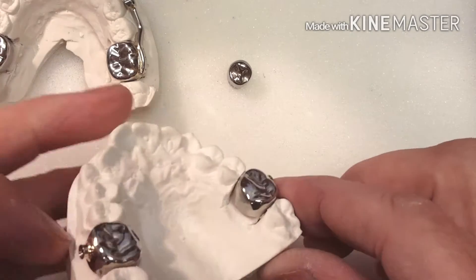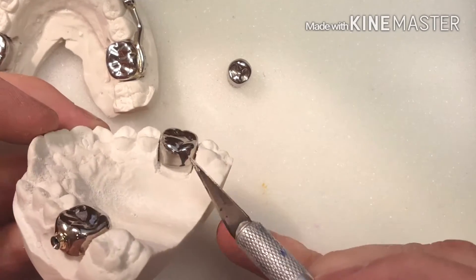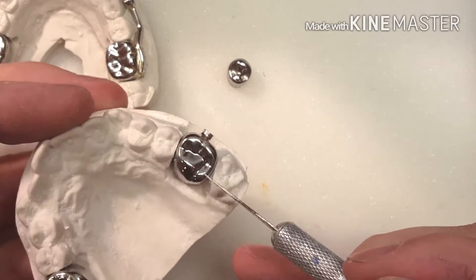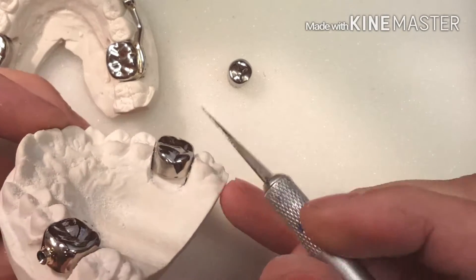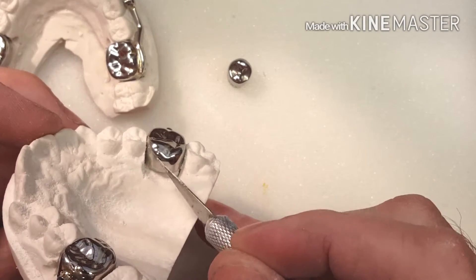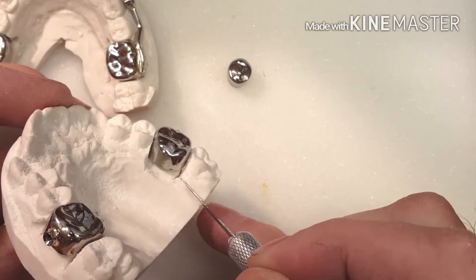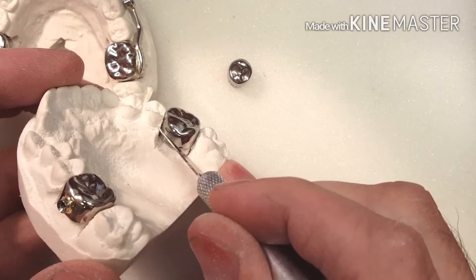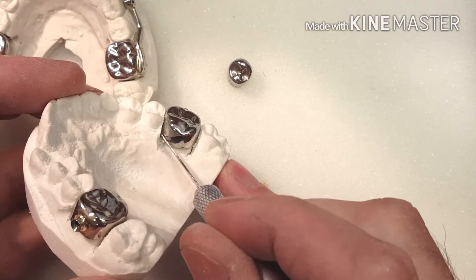The first thing I want to explain is why I'm doing this. The crowns that are pre-attached with the assembly already pre-attached, similar to a 3M Unitec crown, have a mesial portion that is extremely long compared to the distal part. If this is the gum line, the gum line is going to come through here and impinge right here.